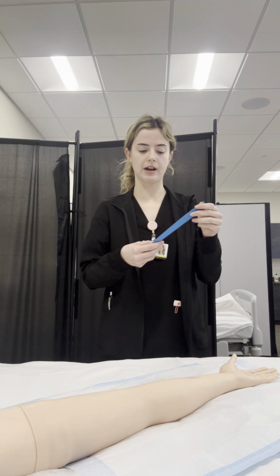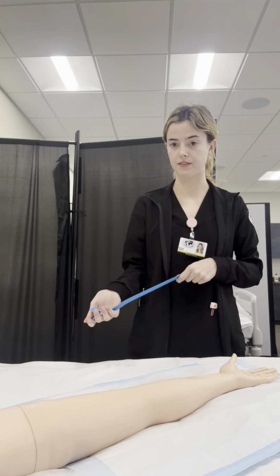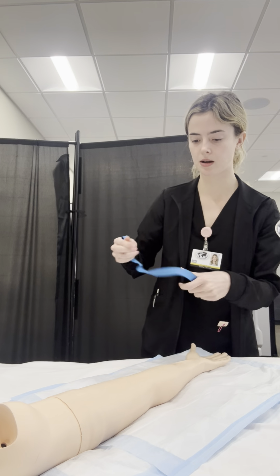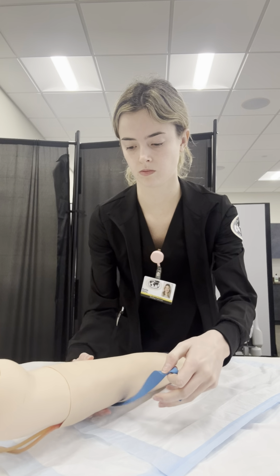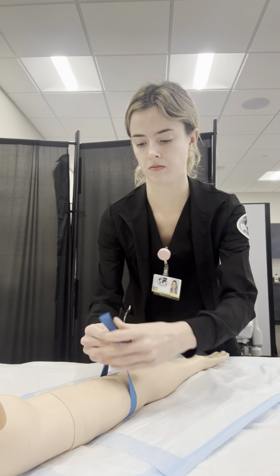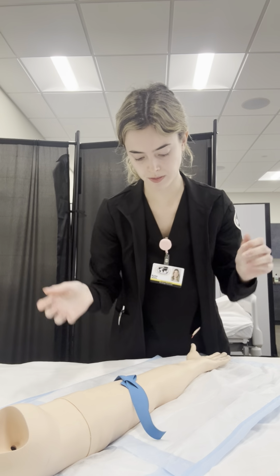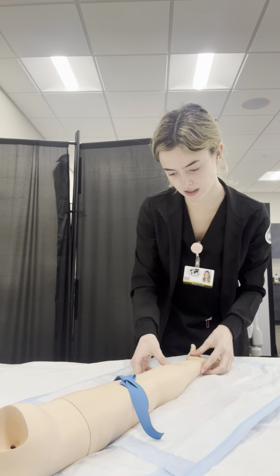Okay, so I'm going to go ahead and take my tourniquet, and I'm going to use this first to assess where I want my IV site to be. So I'm going to place it to the top of the arm. I'm going to have the patient move their arm about right here. Okay, palm side up, and I'm just going to place the tourniquet under their arm. Okay, so I've placed the tourniquet, and now I'm going to feel on the arm for a good insertion site.